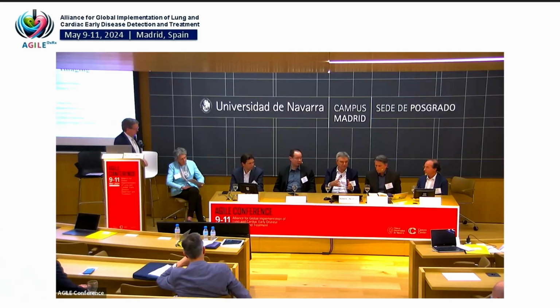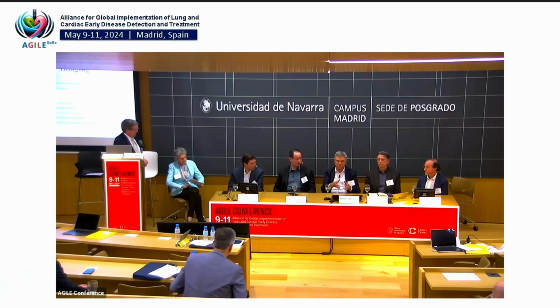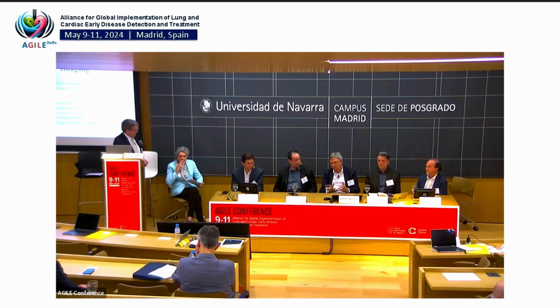Then minus 475, because the EMI units are half Hounsfield units. Then in 1996, there was a real good effort to come to a further determination of what is the best threshold, and they took over the minus 950. So exactly the same, but it's still a proposal.